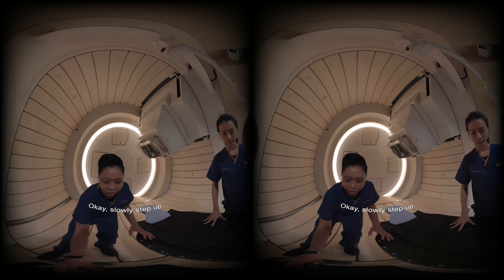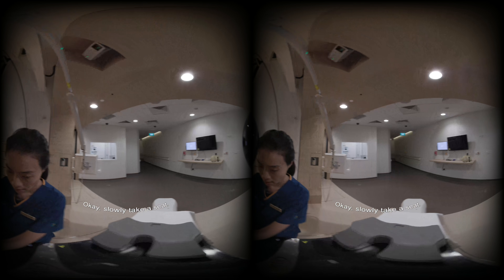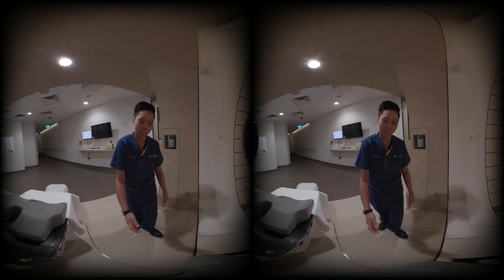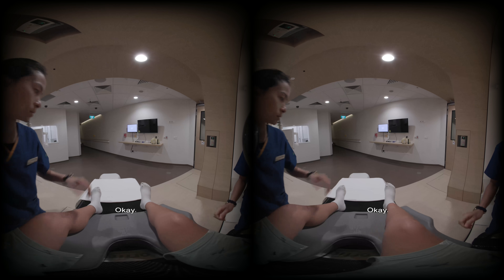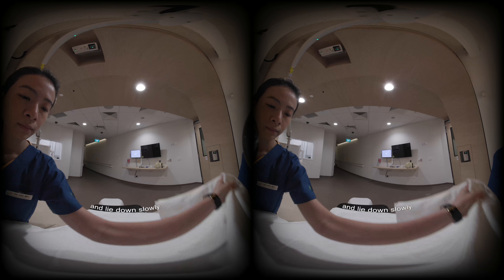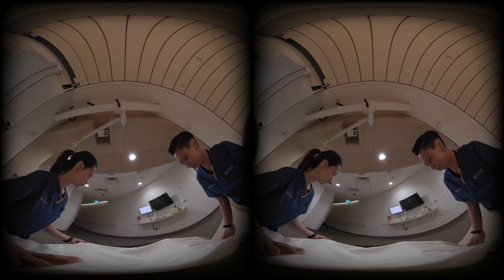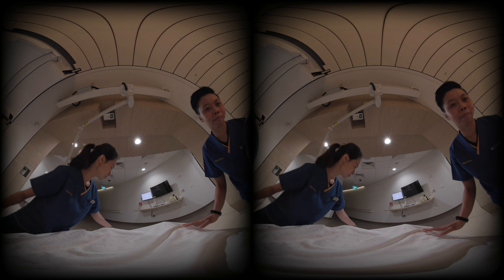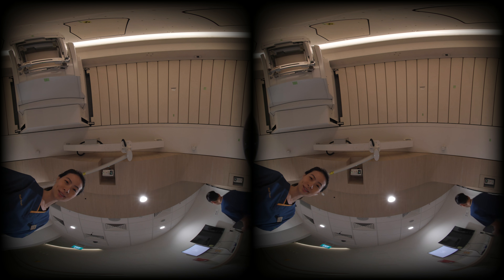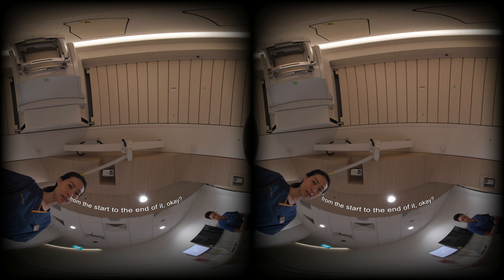Alright, slowly step up. Slowly take a seat. Help you with your legs. Can you shift in a little bit more towards me? Look straight and lie down slowly. We'll be holding you. Just stay relaxed. Are you comfortable now? So today's procedure is going to take about half an hour from start to end. After that, you can go home.